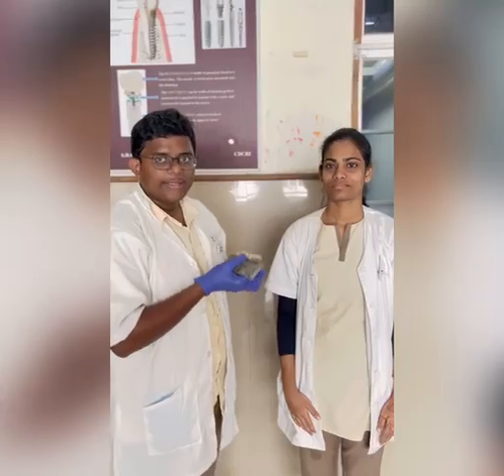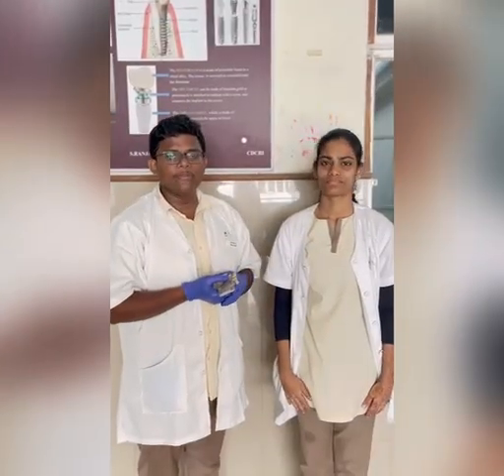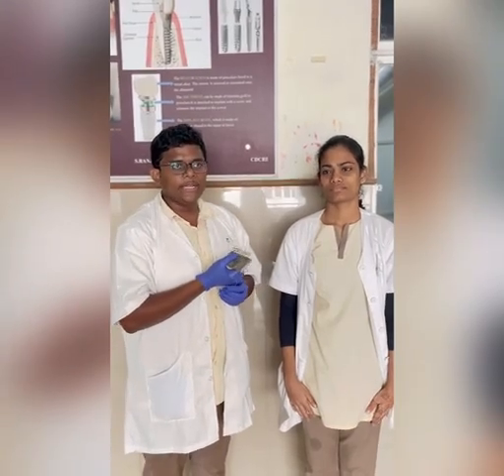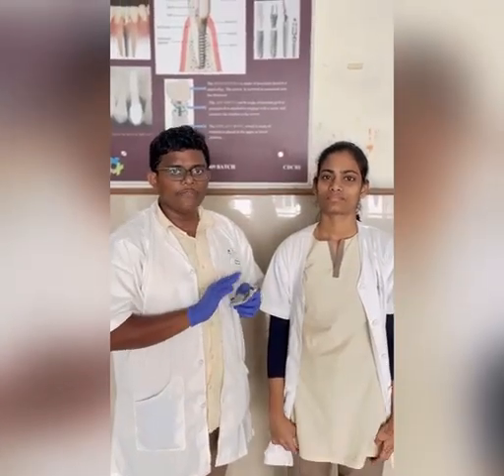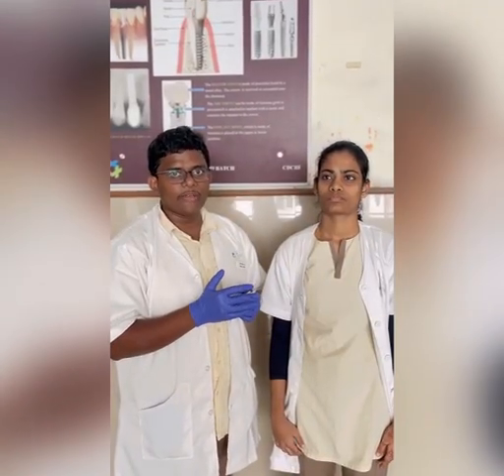The entire shade guide is first scanned quickly with the tooth, and the worst matches should be eliminated first. The shade selection should be made within 5 seconds of keeping the tabs to the tooth, because beyond 5 seconds the operator's eyes become fatigued and it leads to misdiagnosing of the shade. The shade selection should be done in the order of hue, chroma, and next value. The value is better selected by squinting the eyes first.